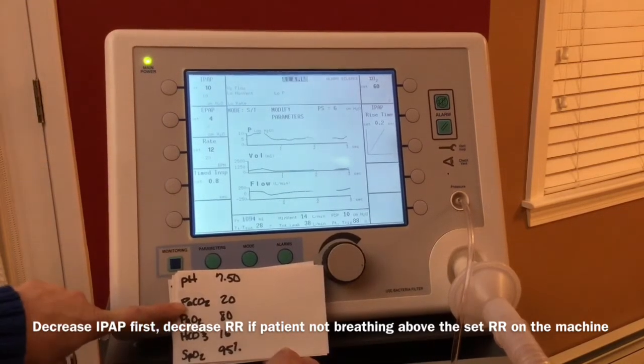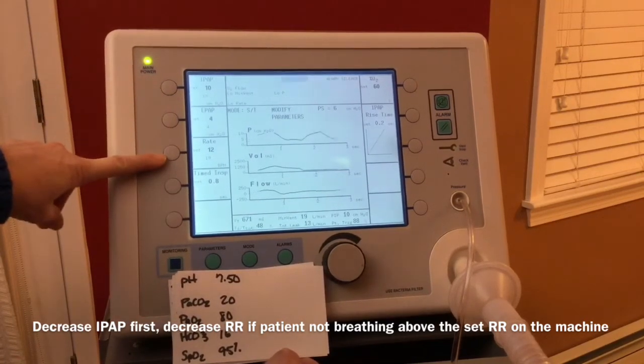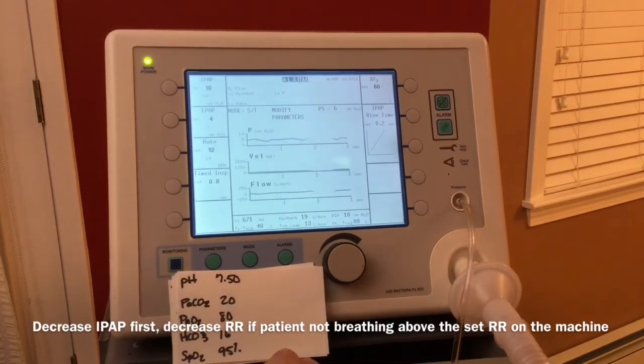This patient is hyperventilating with a low PaCO2. You would decrease the IPAP or decrease the respiratory rate to decrease overall minute ventilation.